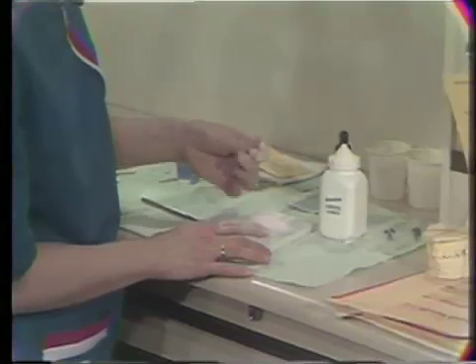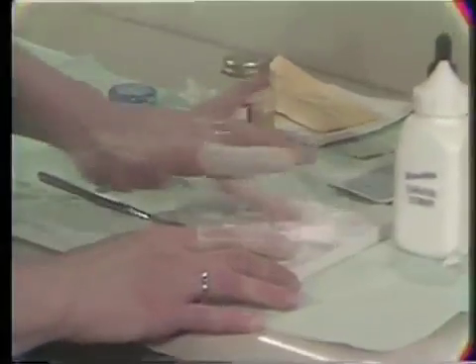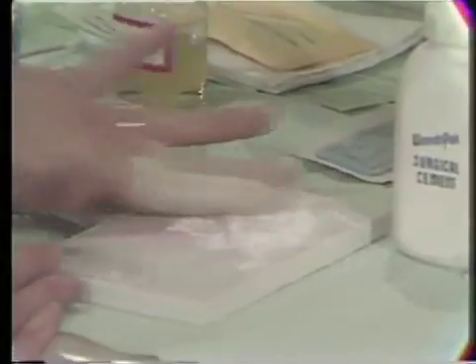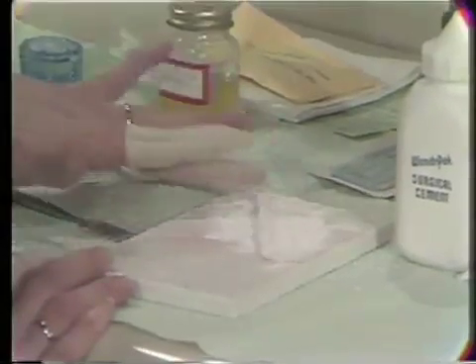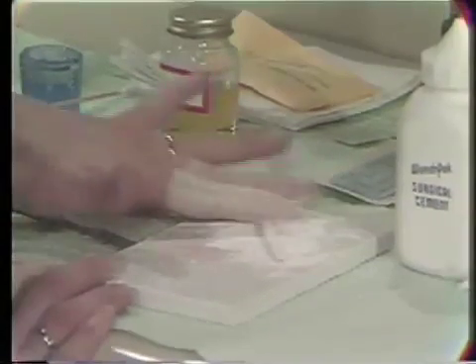If you notice now, she's balling that up in her fingers, and she'll now roll it out into a rope. And sometimes I want it in one piece or two pieces or three pieces, and I want this in two pieces. So she'll roll it out into a rope, and she makes it relatively thin. As she's rolling it, you can see how she spreads her fingers. Then she'll cut it in the middle and hand one end of it to me. But if you notice when she hands it to me, there's a tremendous amount of powder incorporated in that dressing.